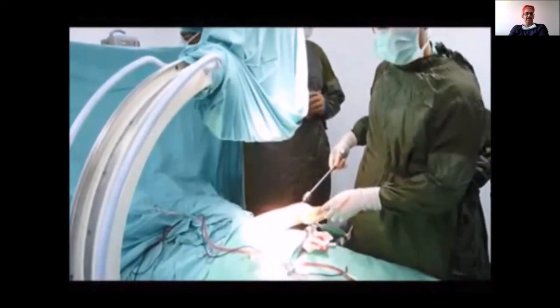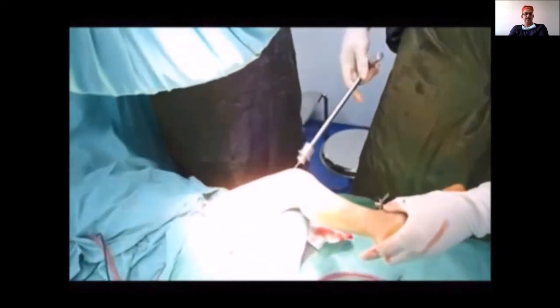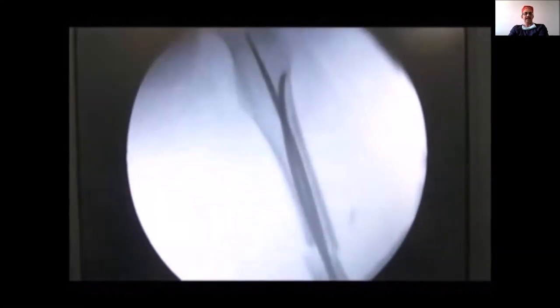Always check the lateral view so you know the fracture is well aligned, and confirm it is stable in both views. Make sure your nail seating is in the metaphysis and has not penetrated the physeal plate.